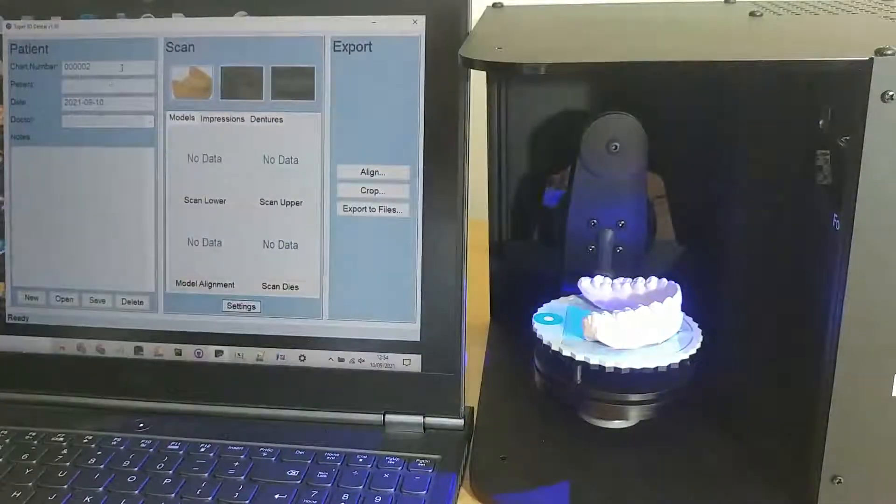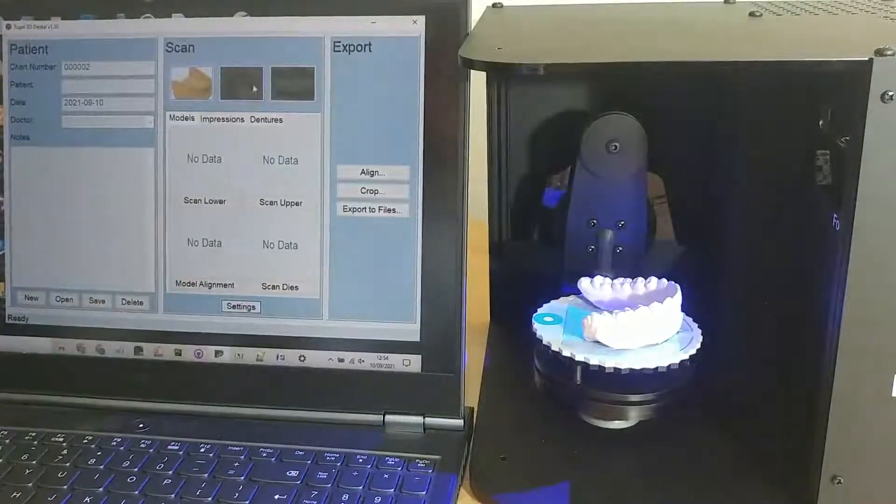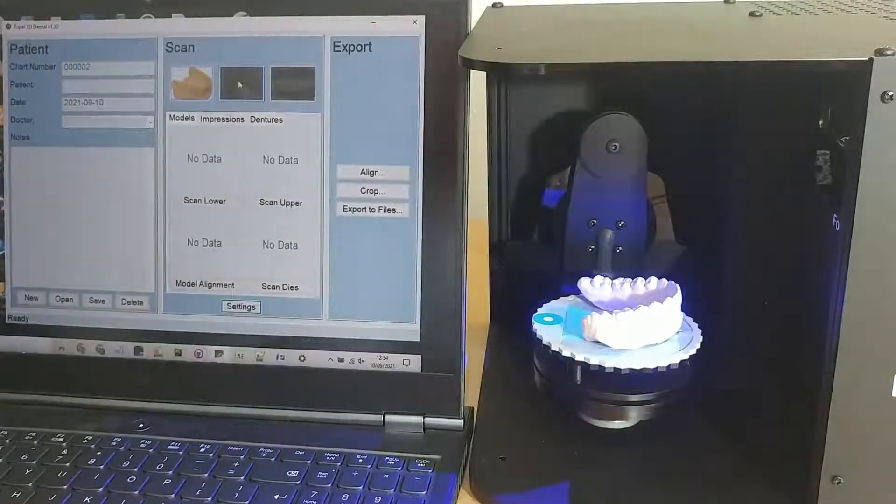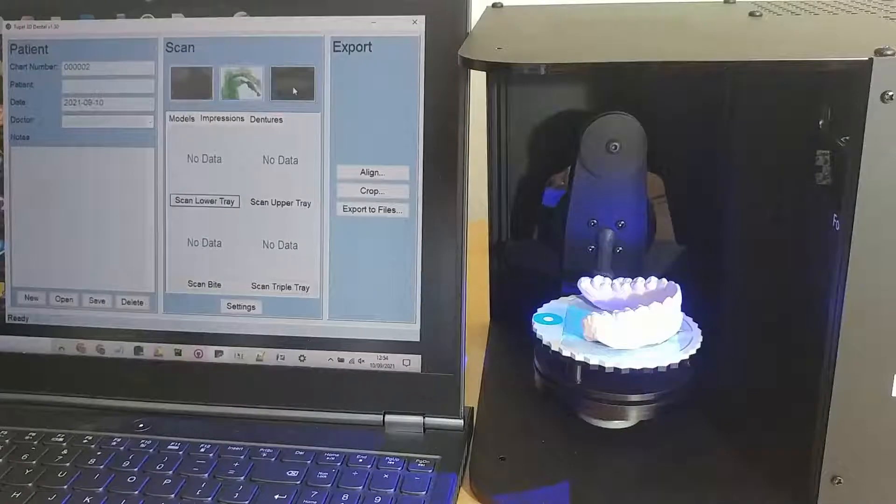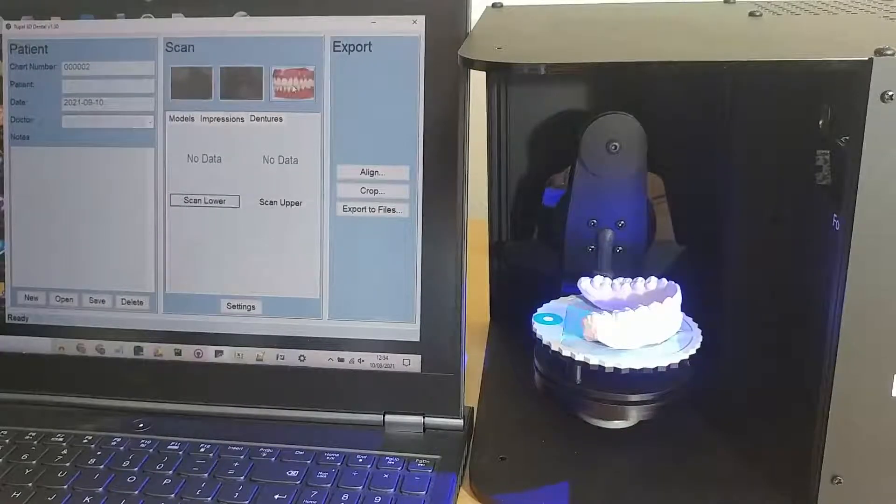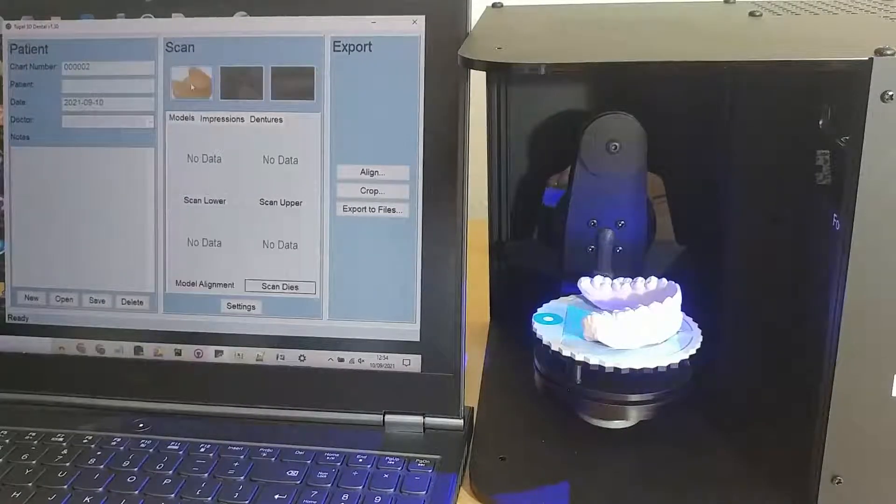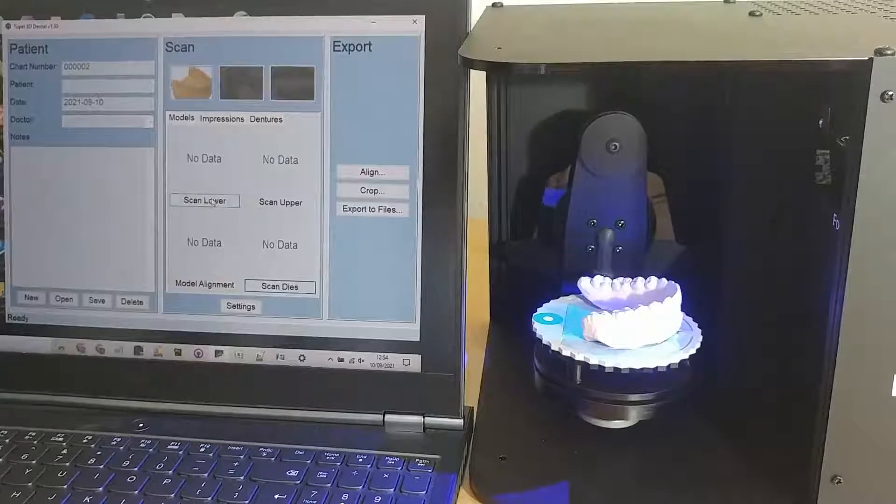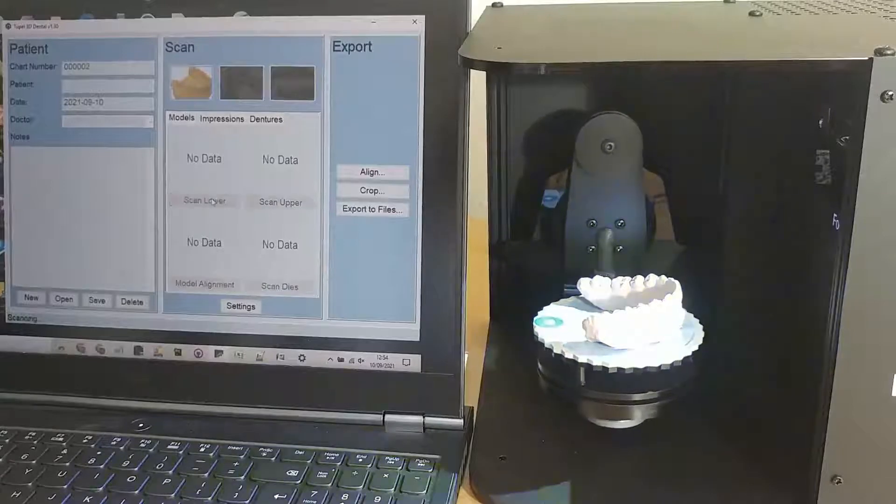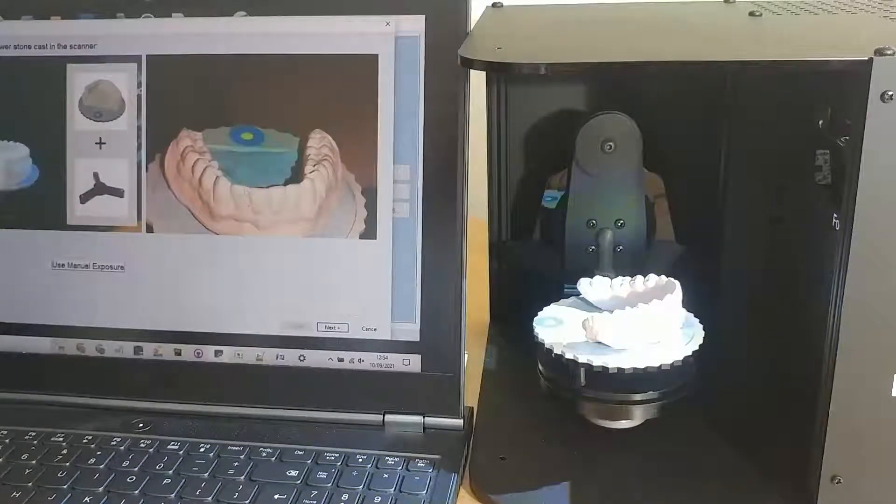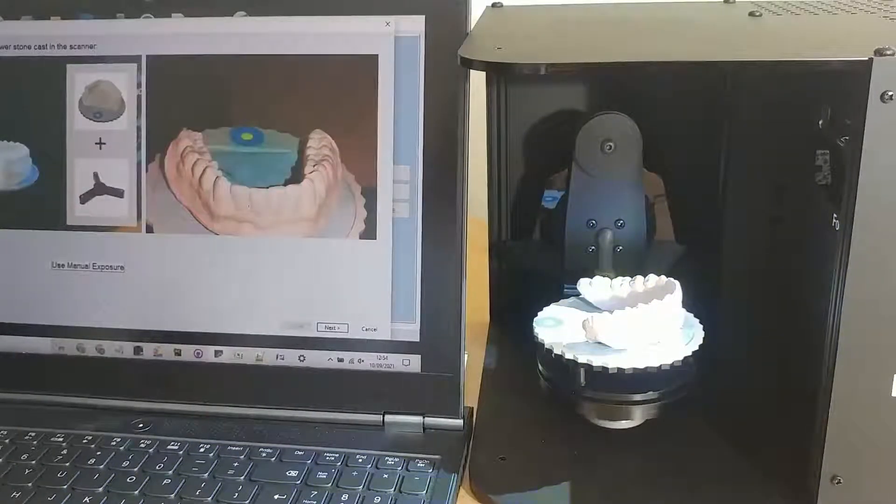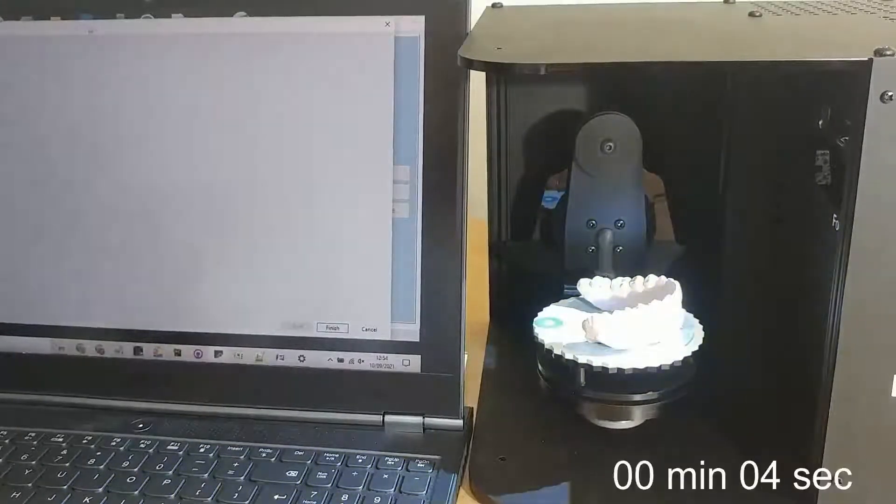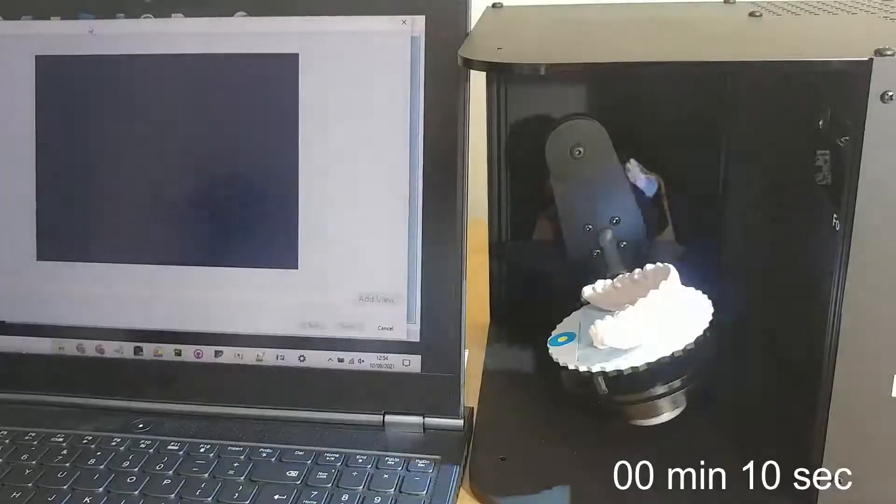In the software we can enter patient details on the left. We can scan impressions, dentures. We're scanning the stone model so we click this one and scan lower. And off the scanner we'll go scanning the model.